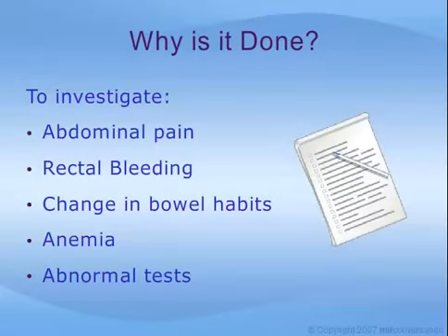Colonoscopy may be done to investigate symptoms such as abdominal pain, rectal bleeding, change in bowel habits, anemia, which is low blood cell count, or other abnormal tests such as barium enema or CT scan. It is also performed in patients with a family history of colonic polyps or colorectal cancer.